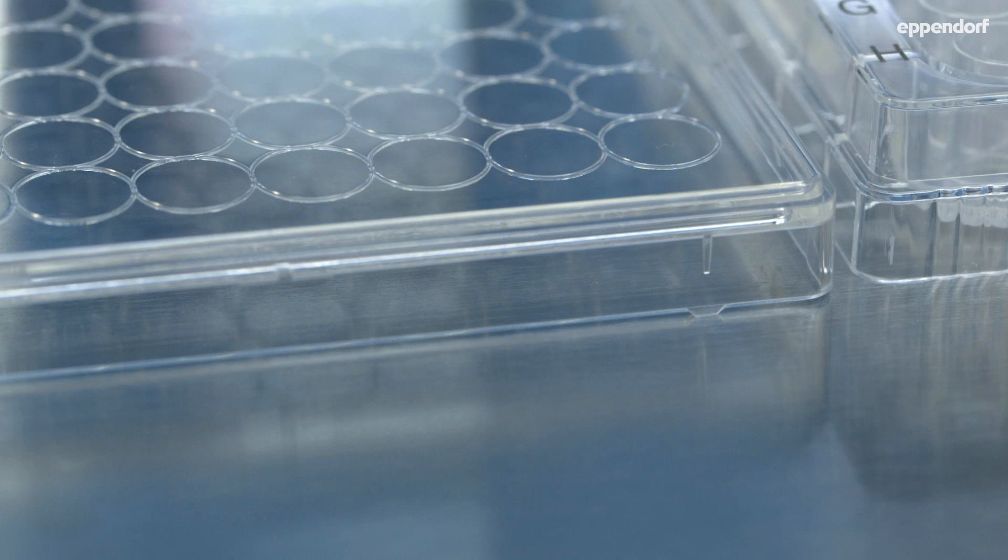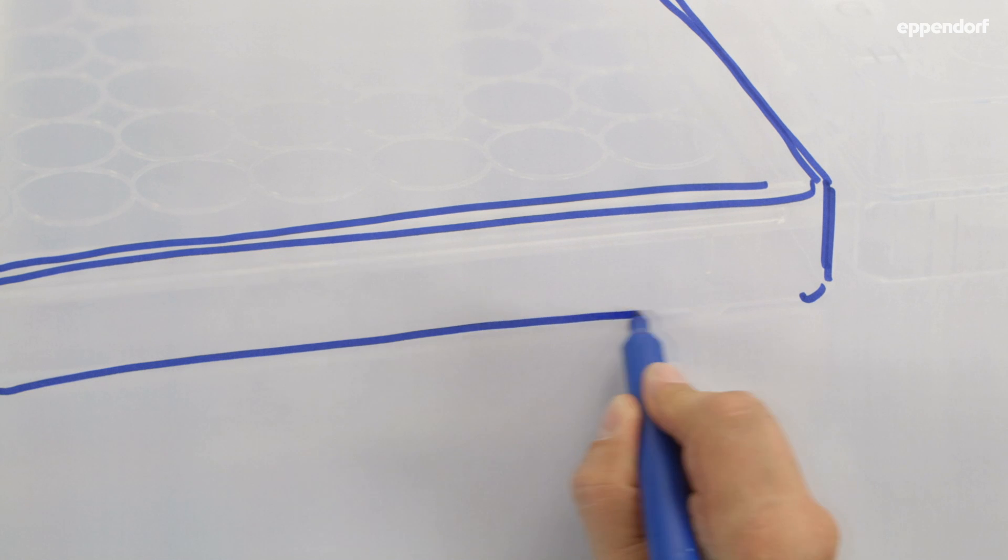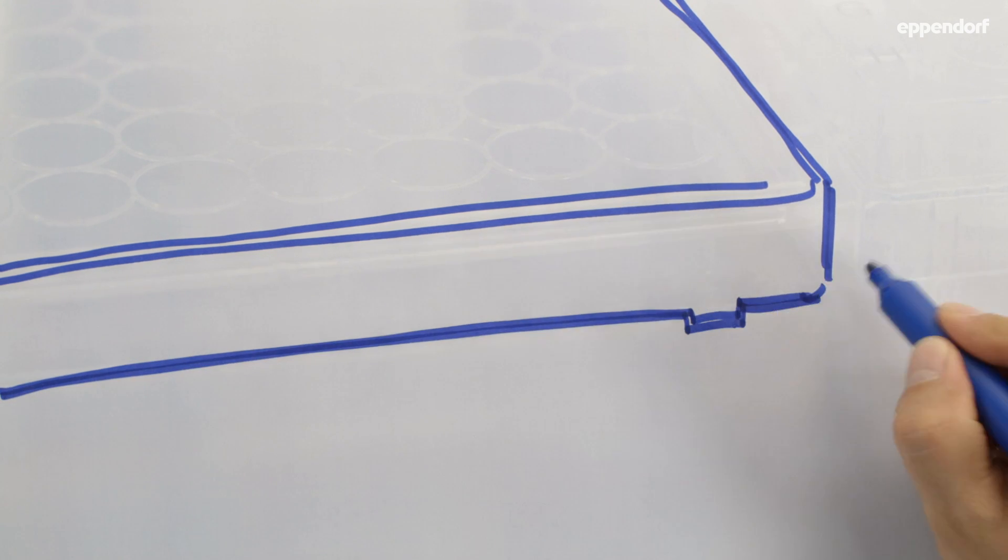Eppendorf cell culture plates have a lid with support taps, which minimise contact with the work surface if the lid is placed to one side. Thus, the risk of germ transfer is reduced to a minimum.